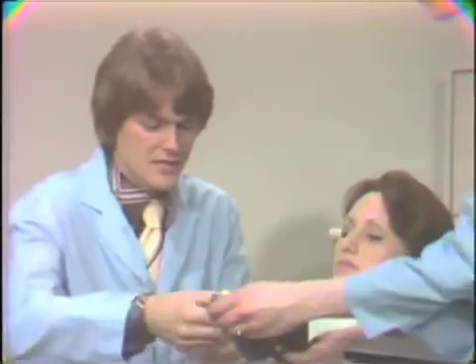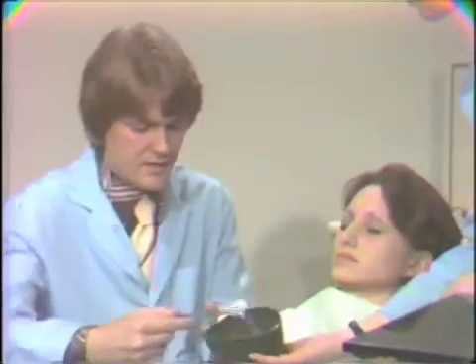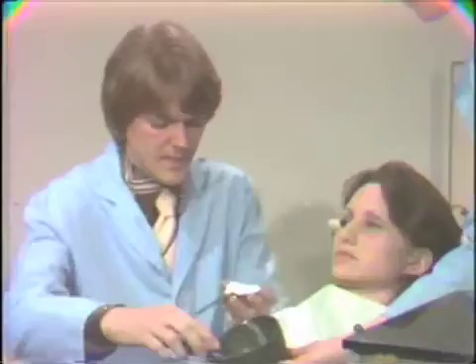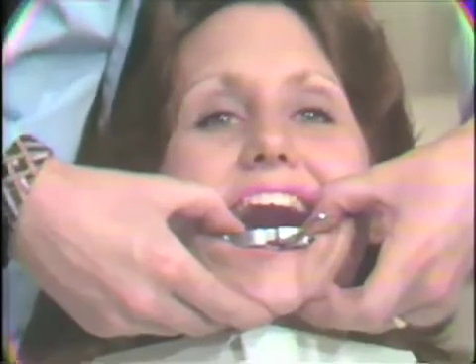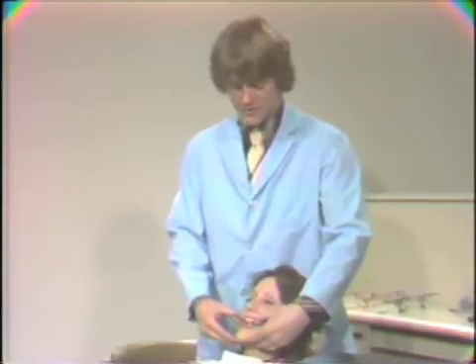First of all, this is filled with some kind of material, either plaster, as we're going to use in this case, or some kind of bite registration paste, and it's attached to the mandible, as we're doing here. Try to get it pointing out as straight as possible in relation to the patient's face. When this is set up firmly, we'll go ahead and assemble the rest of the hinge axis location equipment.